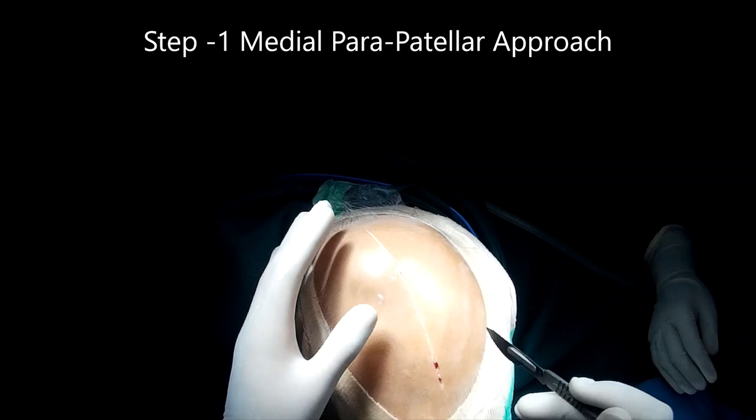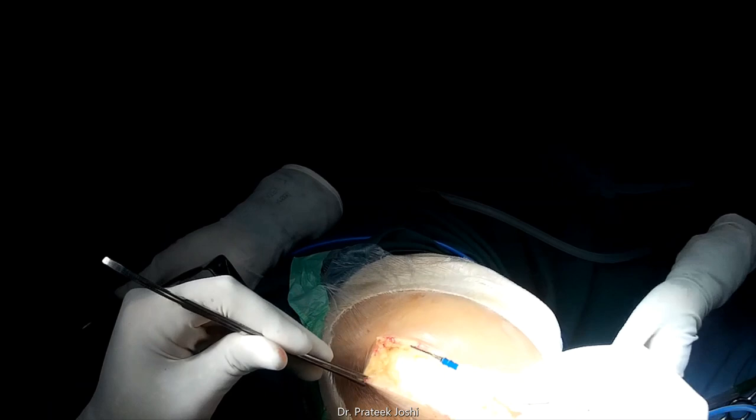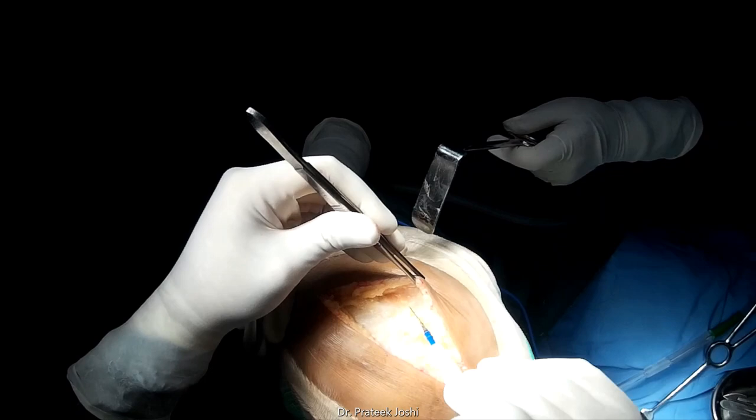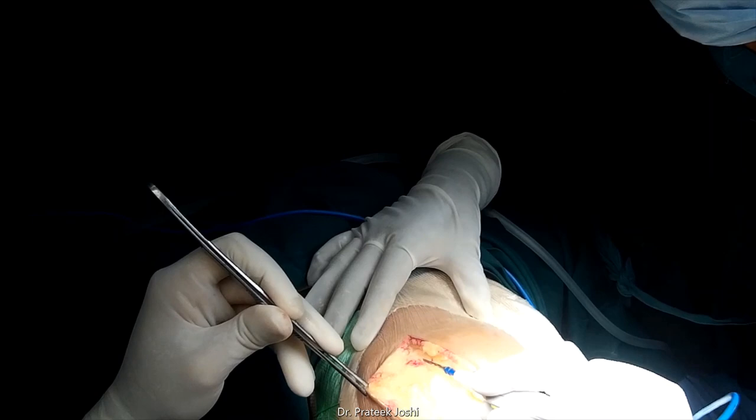We put a vertical incision over the anterior aspect of the knee joint, which should be of around 10 to 15 cm in length depending on patient to patient, and it should extend around 2/3 below the patella and around 1/3 above the patella. Then we elevate a flap consisting of skin and subcutaneous tissue both on medial and lateral aspect of the incision.